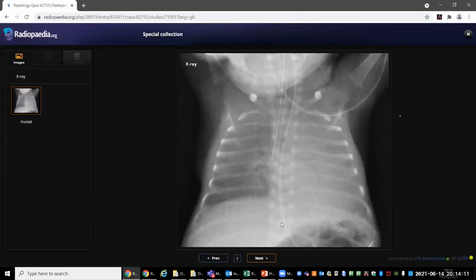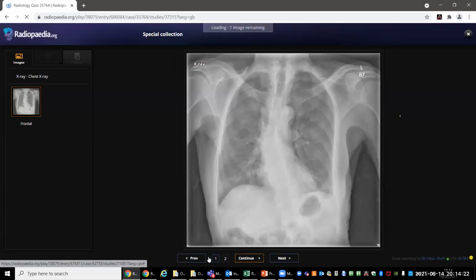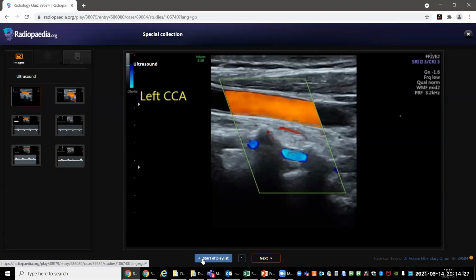Okay. So well done, Vijaya. You did well. So going back to the very first case, which was the subclavian steal, you knew it from the very moment you started, but I think you dragged a bit on it. You could have just wrapped it up very quickly. So it was the subclavian steal, and you should do further imaging. You need to get the location of the obstruction for the surgeons or the interventional radiologists that may want to do something about it. So you need to do a CT contrast to assess the subclavian artery. So that was very well done.